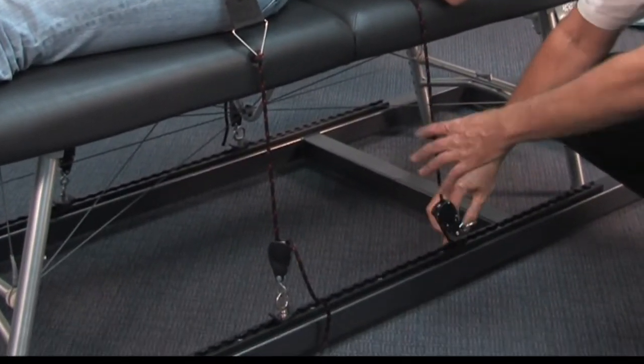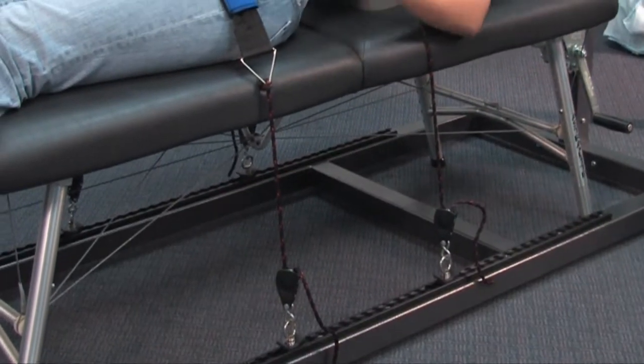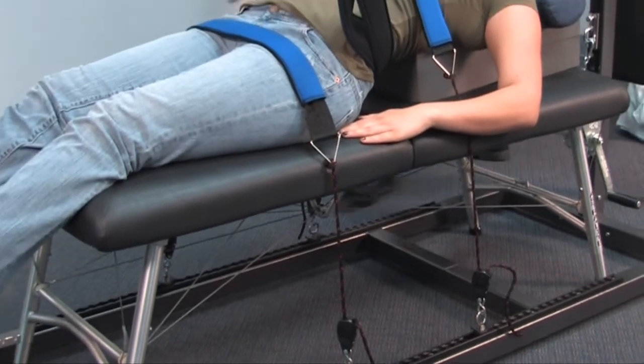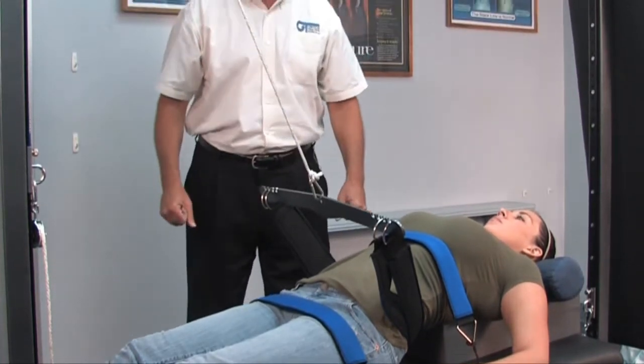Again, we simply lock in our load lock and pull our rope tight. This will help to keep the patient from raising completely off the table and help to concentrate the traction into the lumbar spine.